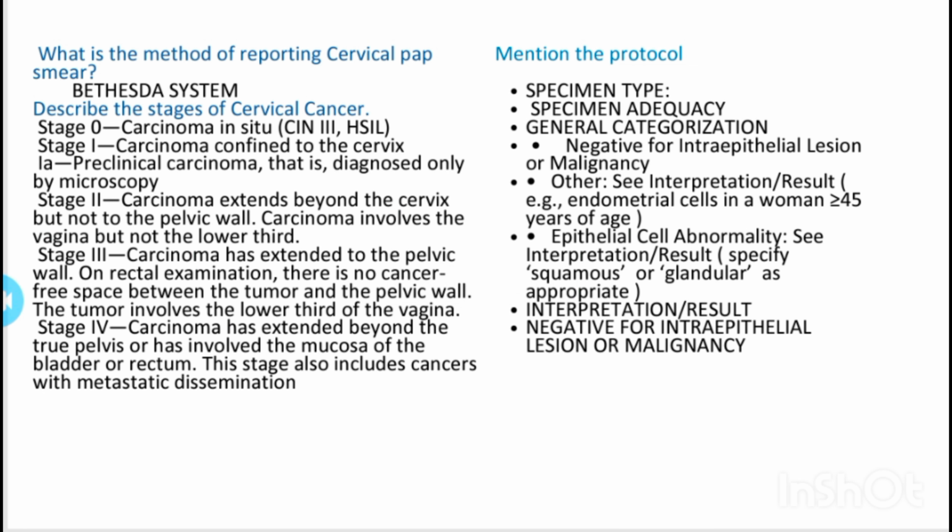If any inflammation is there, then inflammatory cells, that is neutrophils or lymphocytes, you have to see. Along with that, organisms you have to see. Any bacterial vaginosis, like coccobacilli, Trichomonas vaginalis, then Candida, all these things you have to observe in the background. This is how the background should be seen. And also any material in the background like blood, mucus, that also should be seen and reported.